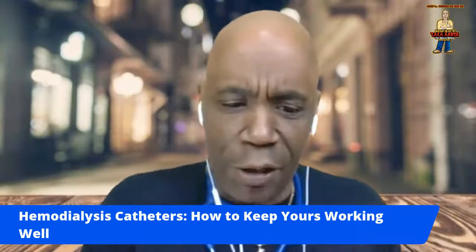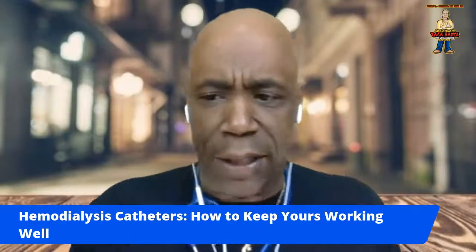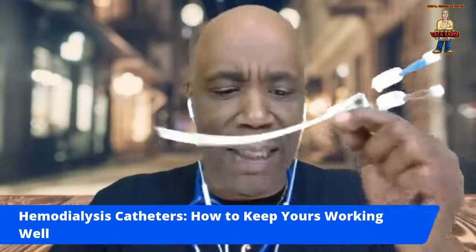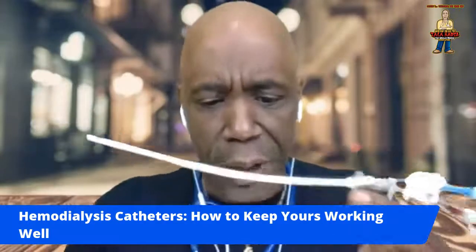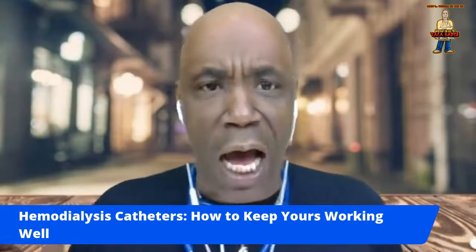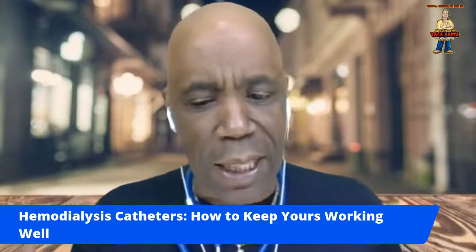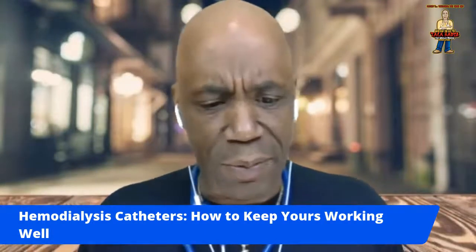Now, the catheter used for hemodialysis is a tunnel catheter. Now, this is what this is. It's a tunnel catheter, meaning that because it is placed under the skin, it's referred to as tunnel. There are two types of tunnel catheters, cuffed or non-cuffed. Non-cuffed tunnel catheters are used for emergencies and for short periods, up to 3 weeks.